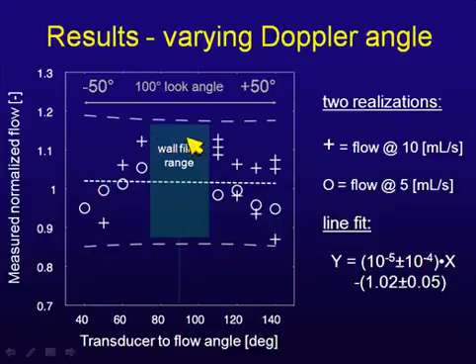What you'll notice, however, is that there is a wall filter range in which you can't detect Doppler. And clearly that occurs, this is a Doppler technique, so if you're absolutely perpendicular to the flow, you can't see flow. So this measurement will not alleviate that problem, so there's a dead area in the middle, just like there is with any Doppler technique. But as long as you can measure Doppler, this thing works really well.